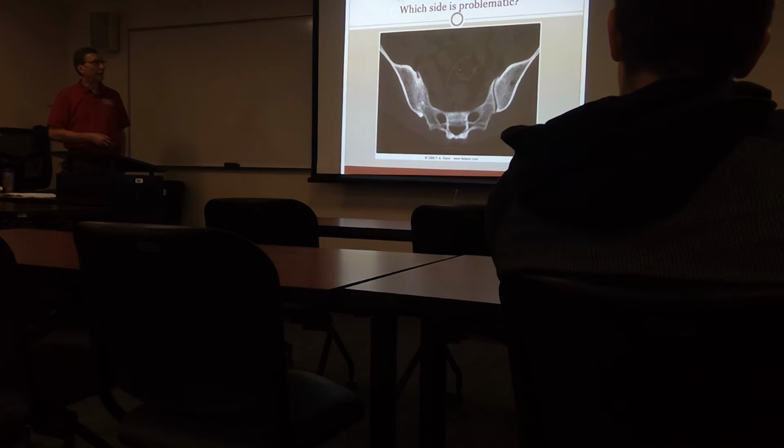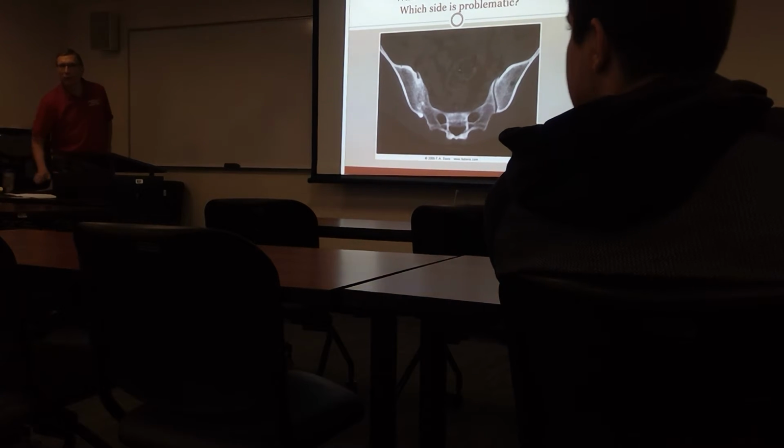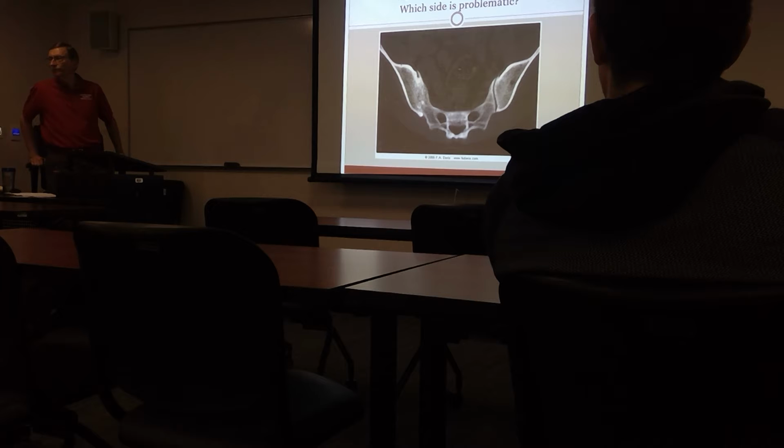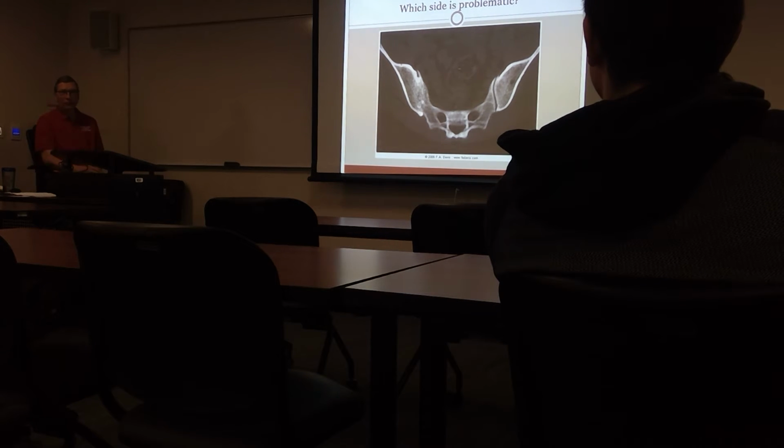So what are we looking at here? And which side is problematic? This will stretch your brain a little bit. But it's something you guys have seen before. This is human. You're looking from below. Remember, you're at their feet. It's a slice through the body.